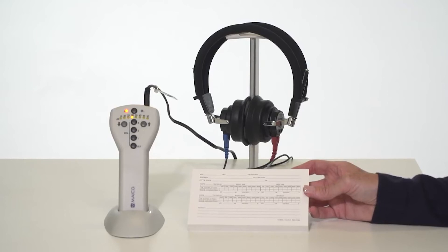Results can be captured on the included audiogram pad or your office's preferred documentation method.